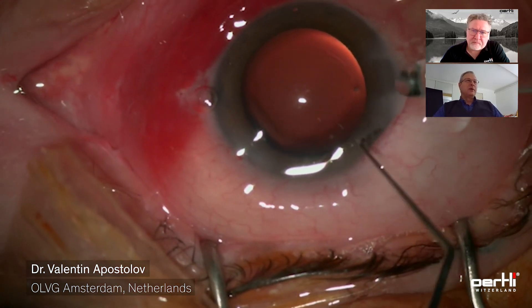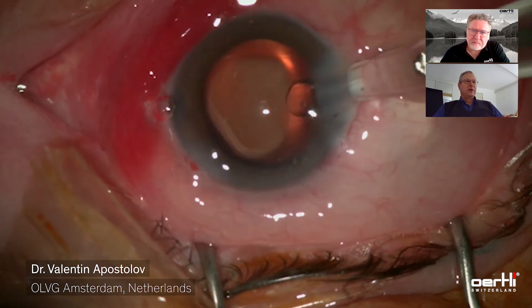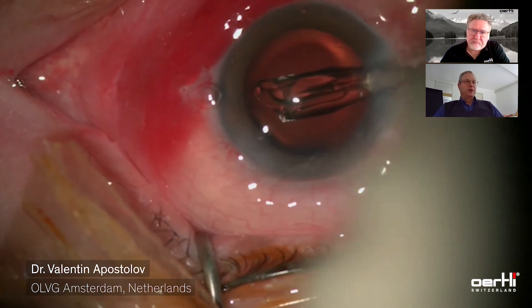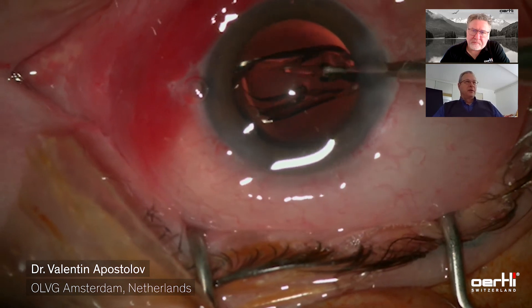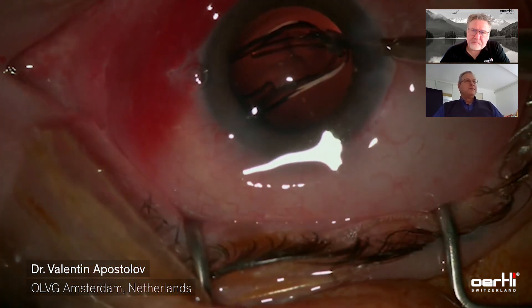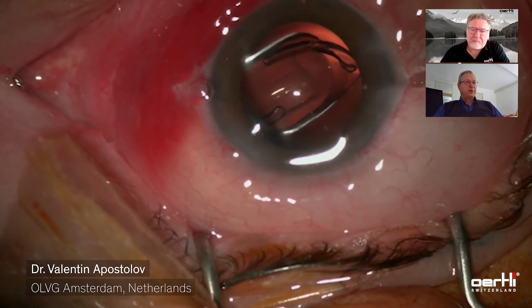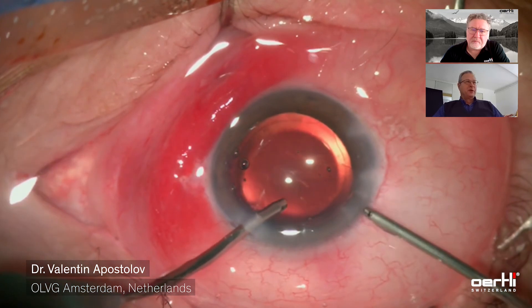I like to hold the eye with the chopper, not tilting it while introducing the lens inserter. Here's the lens into the capsular bag. The OVD has to be removed, and I'm quite fanatic about removing it completely, as a number of my patients also have glaucoma and I really like to do my best to avoid pressure spikes.